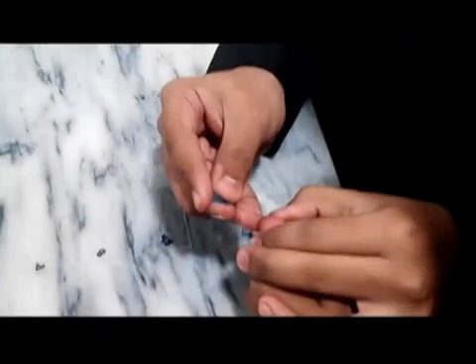Now I am going to take some blood drops from Mr. Muhammad Hussain. Please put your finger here. I've taken one drop — he's feeling a lot of pain, but that's good for science. You have given three drops for science!